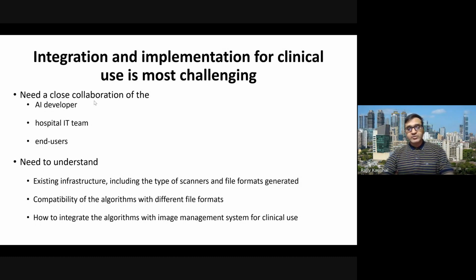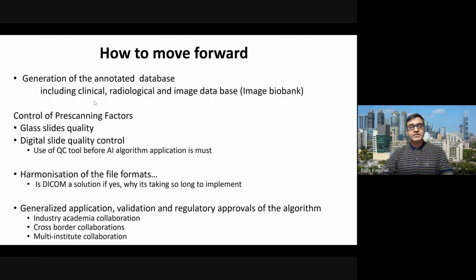And the models which are used should be generalized, then they become of clinical utility. And to move forward, there is a need for the generation of an annotated database, so that these can be properly cross verified and cross validated.